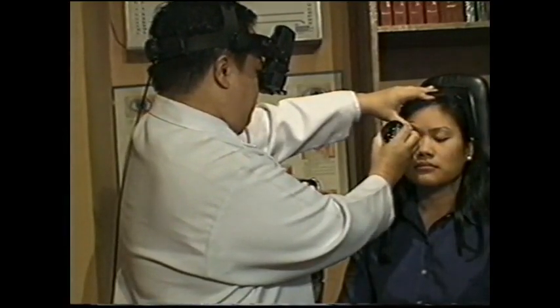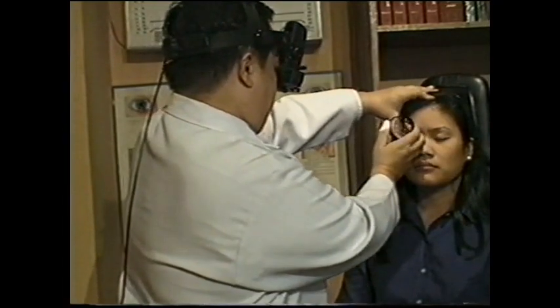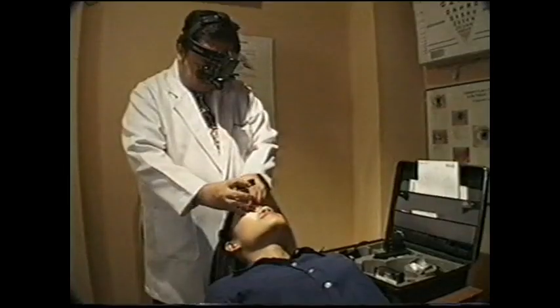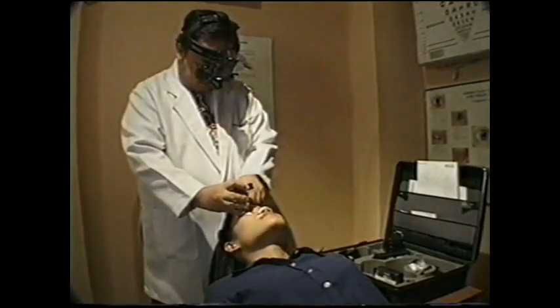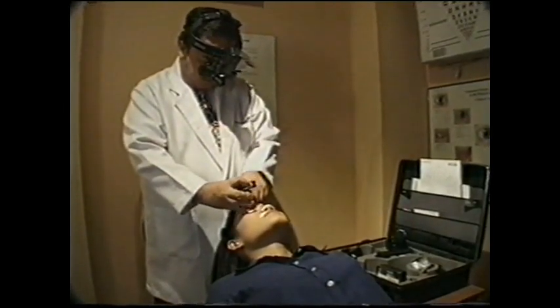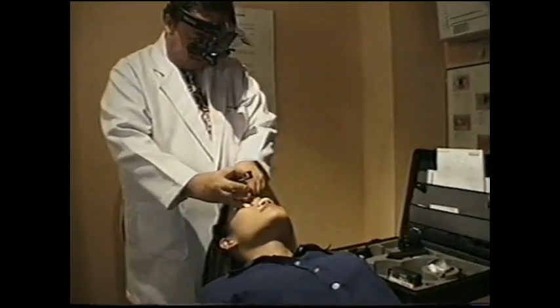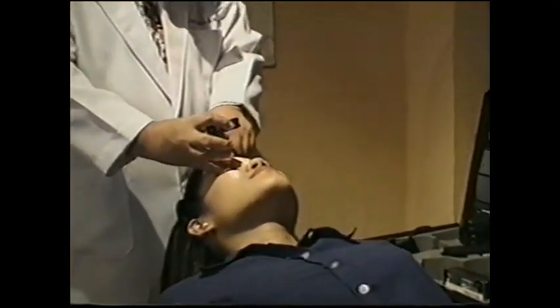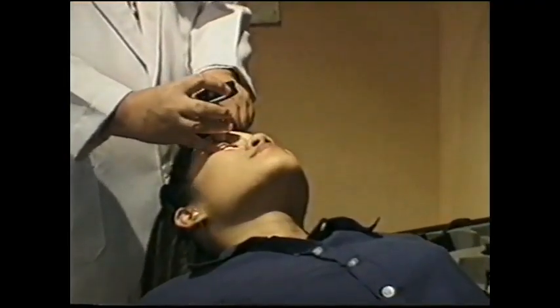Indirect ophthalmoscopy is possible to perform with the patient sitting upright in the examination chair. However, if the examination will take longer than a few minutes, or when scleral depression is to be performed, it is easier with the patient supine. The examination room should be dimly lit, and the ophthalmologist should be dark adapted.